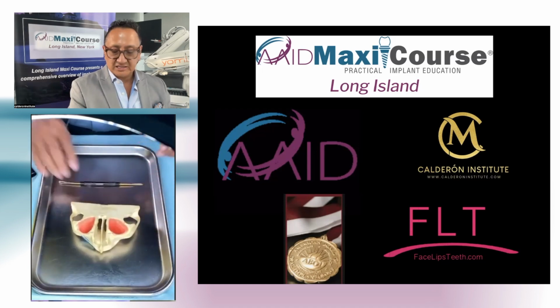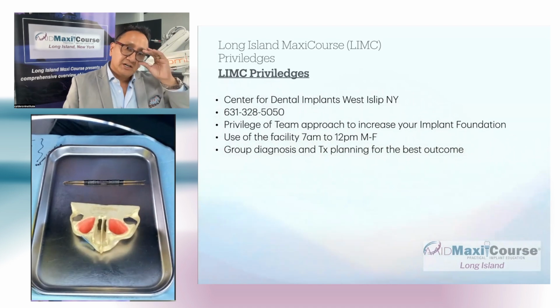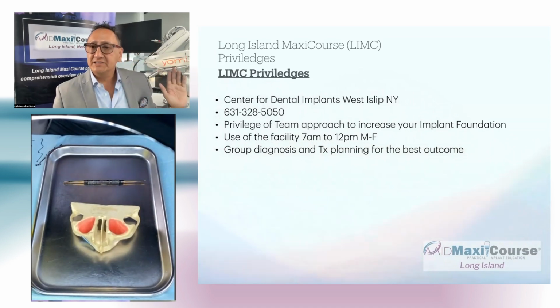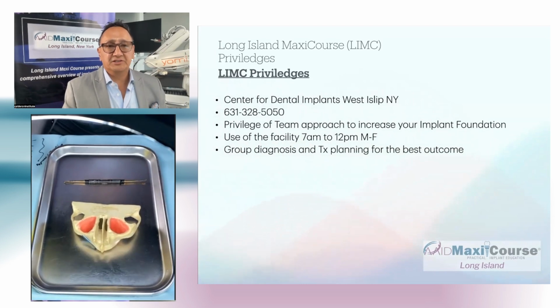So I'm going to show you that. Let me take you to the slideshow right away. So this, again, I call ourselves the Long Island Maxi Course, LIMC. And LIMC privileges means that when you join our group, you can use this Yomi robot whenever you want. I don't have to be here. Our team takes care of it. Just like you're going to a hospital with privileges, now you have an office with privileges.